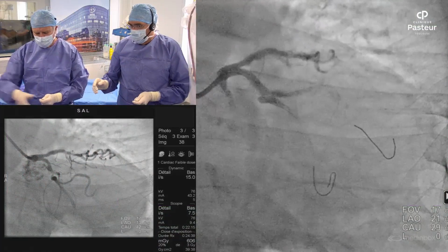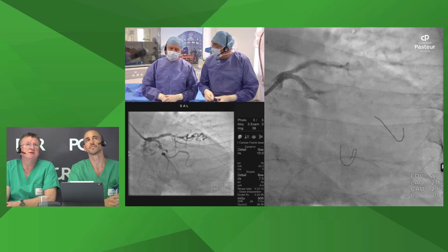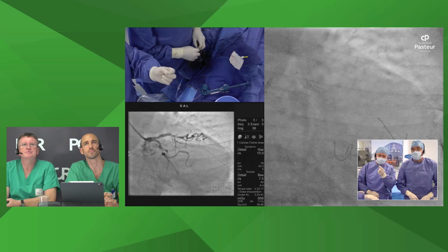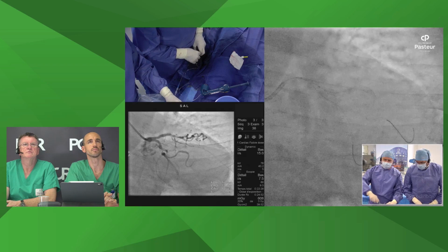And when you do the pot in the proximal vasculature here, you'll leave the OM2 wire still in, since you have no concerns about pulling that wire after the pot in? Well, it's a good point, because for this particular patient we have a lot of tortuosity, and it could be a problem. Sometimes what we can do is pull back the wire till the radio-opaque part, in order to limit the risk of resistance when we pull back the balloon. But most of the time it's not an issue to leave the wire jailed. Here it's okay.